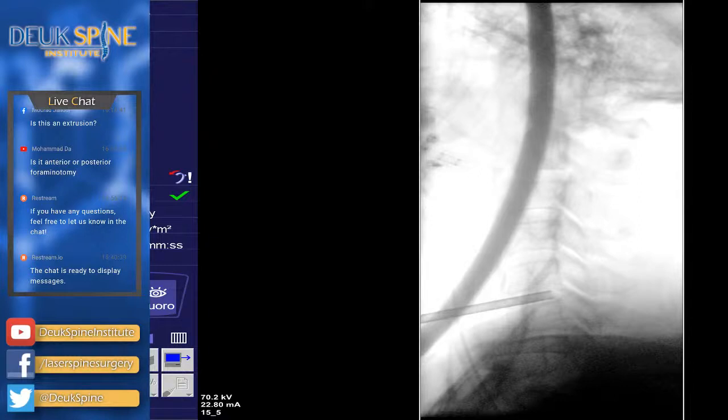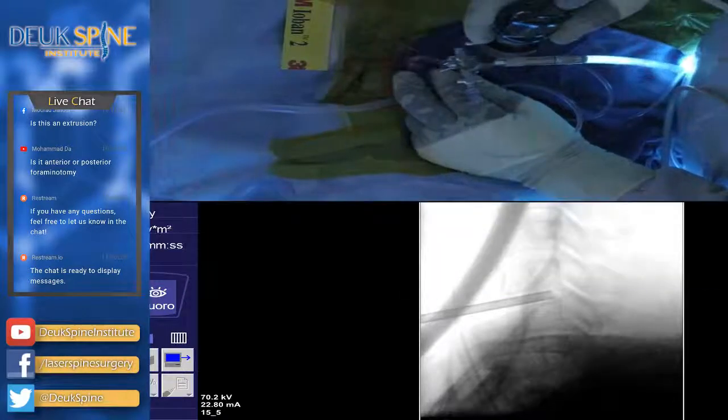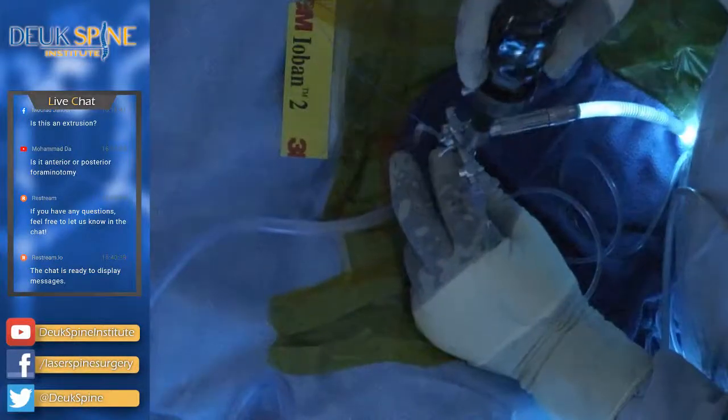So we are going through the front of the neck. This is an anterior approach, transdiscal. We're going through the normal disc, but we're leaving the normal disc alone. Every other spine surgeon in the world takes the disc out. Okay? This surgery could never be performed with a foraminotomy because we're not talking about a foraminal disc herniation. I need the endoscope view back. We're talking about a herniation that is anterior to the spinal cord.